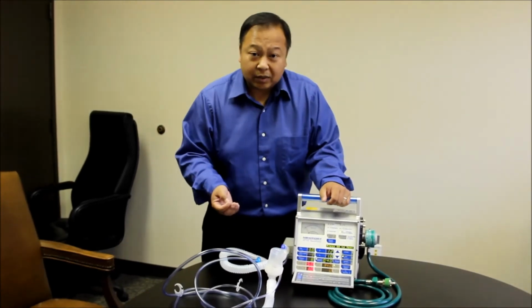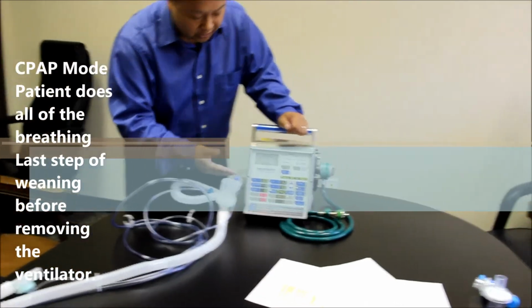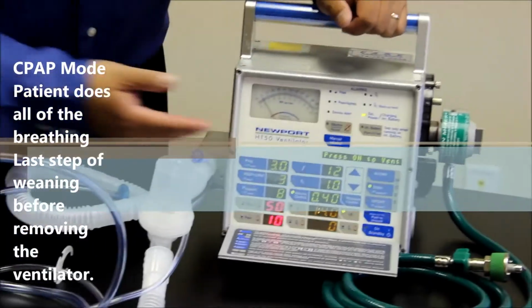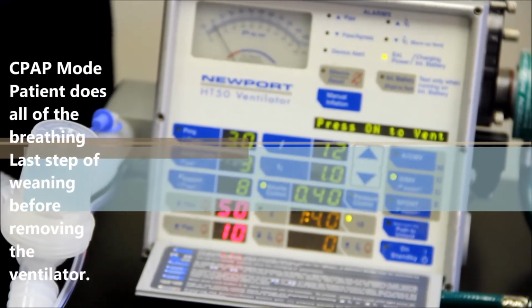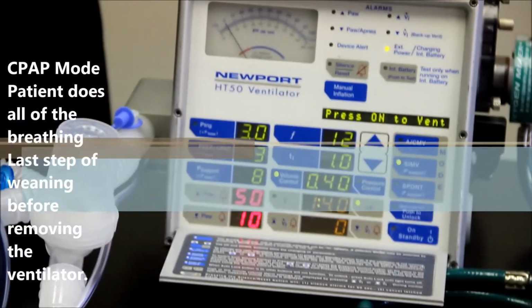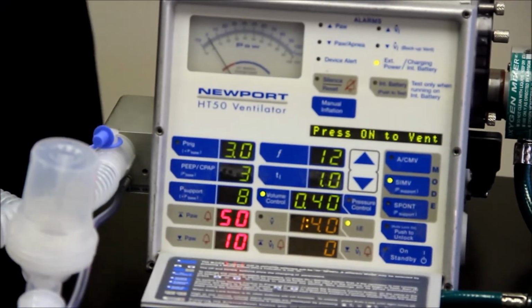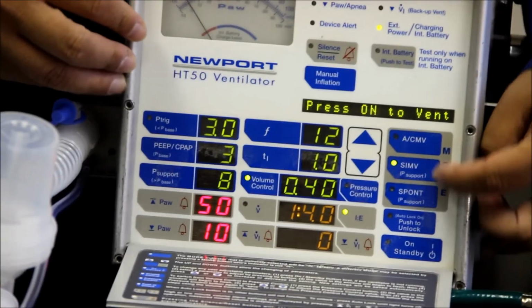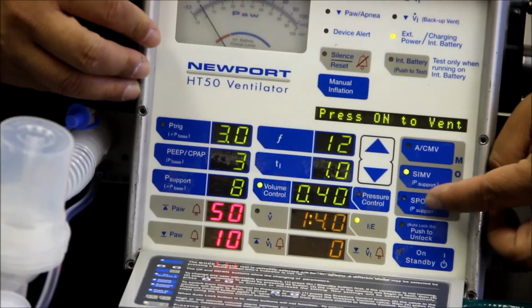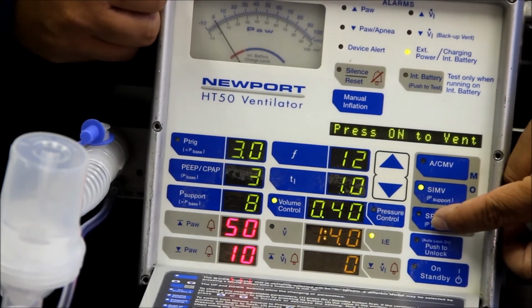And the final mode that I want to talk about is CPAP. CPAP, or pressure support mode, will allow the patient to breathe entirely by himself. The only thing that we're doing is providing pressure to compensate through this tubing, like the SIMV mode. So you'll see, when I switch the patient from SIMV mode to spontaneous breathing, which is CPAP, you'll see a few changes.